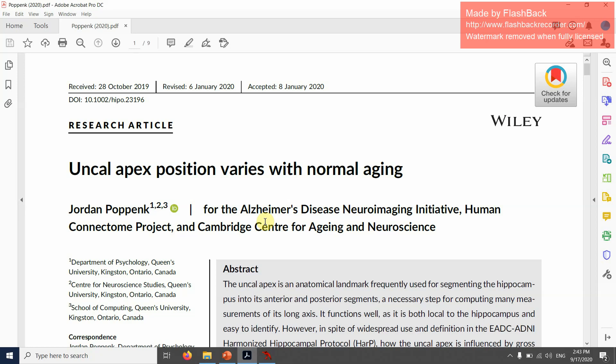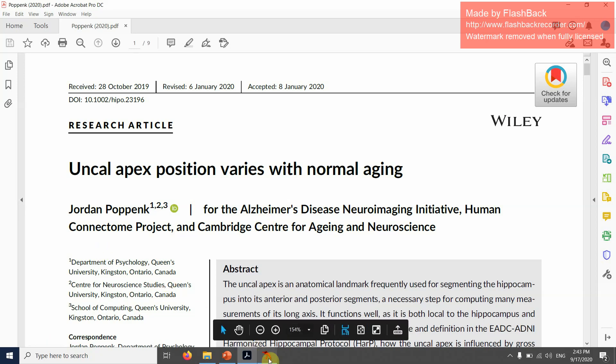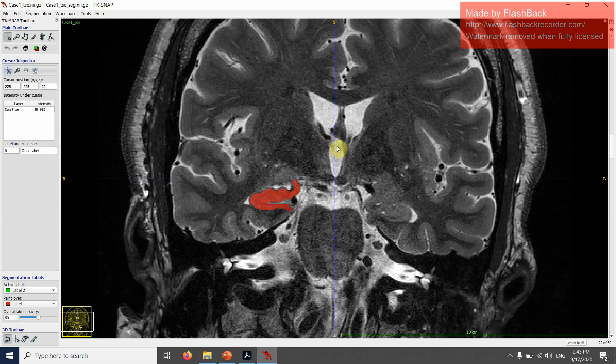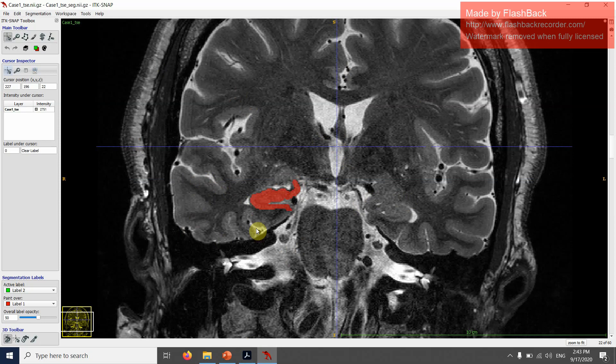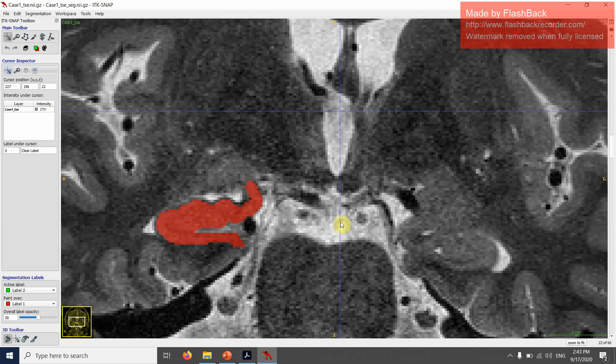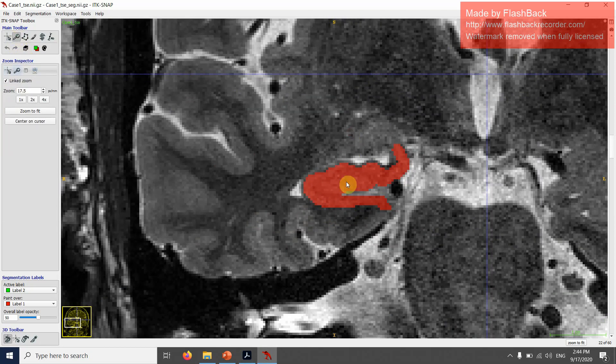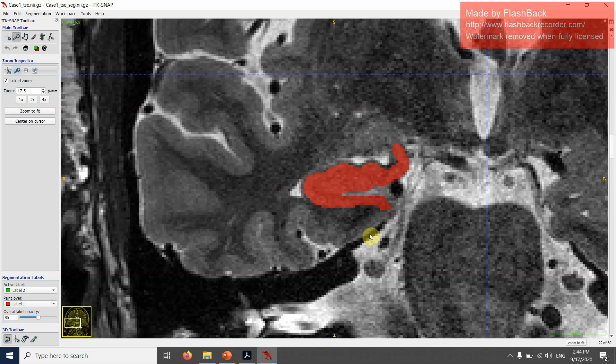Now I want to give you a couple of examples and show you how you can do this in practice. I want to start with this example. This is a T2-weighted MRI scan. The gray matter is actually a little bit lighter than the white matter, and I'm going to give the example in the right hemisphere. In the hippocampus, as you can see, I already segmented it. The use of this rule assumes that you already segmented the hippocampus, and then you can divide it into anterior and posterior afterwards.